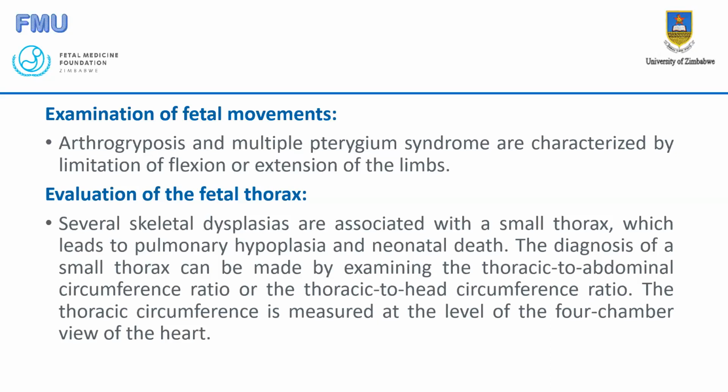You should see some movement during scanning. If you don't see them, then it's not a good thing not to see the movements. What else can you do to encourage the movements? If it is a case where you are borderline and you're not sure and you really want to see the movements, you can encourage the mother to just go and take a cold drink or just a glass of cold water. Normally, that should bring about the movements in babies who are normal, who have the movements in them. So that's another maneuver you can also do.